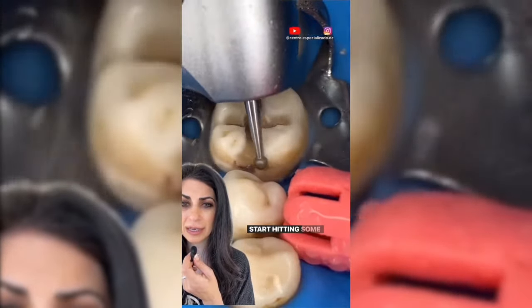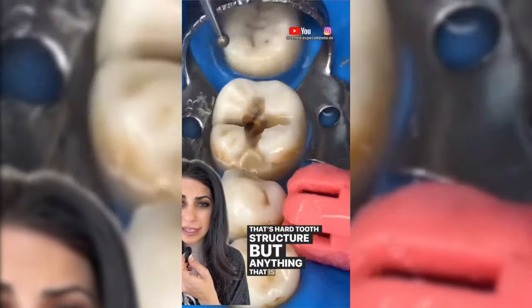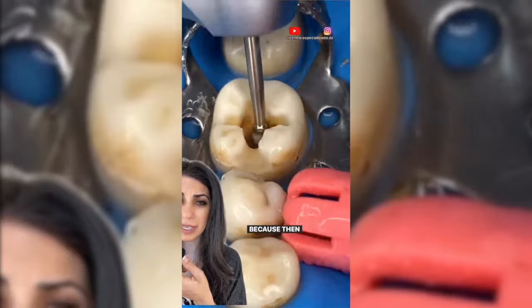In a couple seconds you'll see he's going to start hitting some nice bright yellow tooth structure — that's healthy, hard tooth structure. But anything that is soft must go. Right in the middle where it's really deep, we're hoping it doesn't go so deep that it hits the nerve, because then the patient will need a root canal.